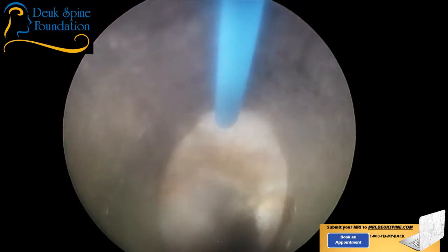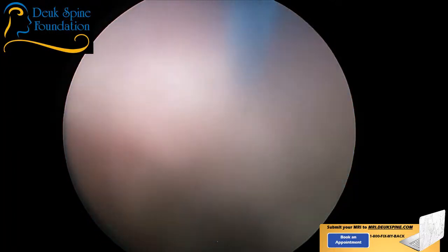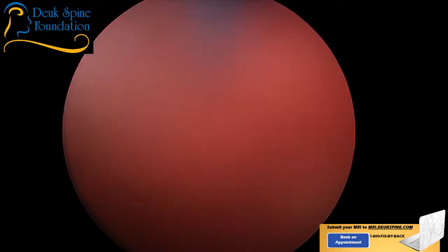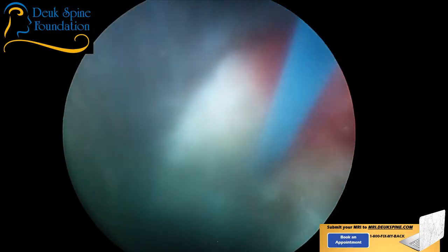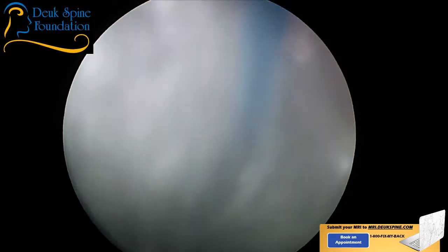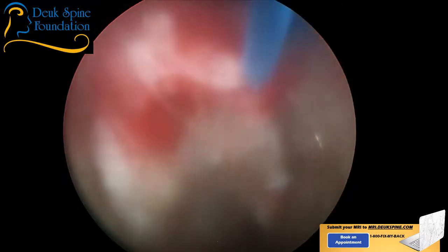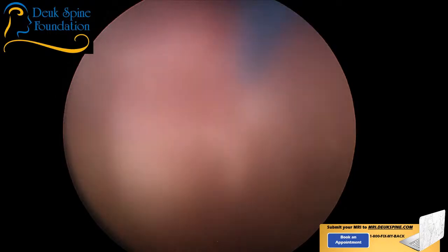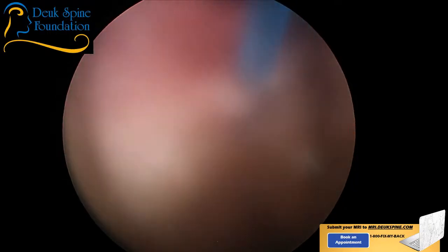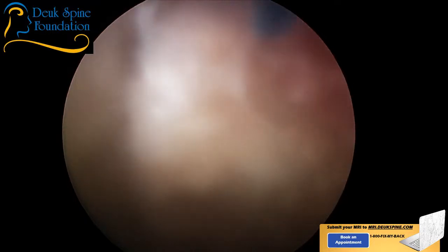So, we came into this cave, this tunnel, this chamber, and we found Medusa, the source of this patient's pain at this disc, in this realm, in this region. And we took care of Medusa. Okay? So, her pain will be gone. Now I have to decide what to do about L3-4. That's a tough one. I'm going to try and get in there.